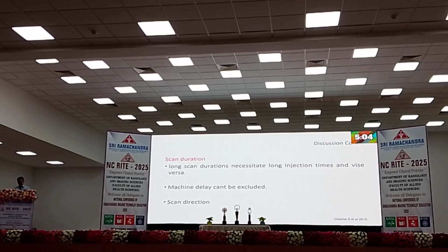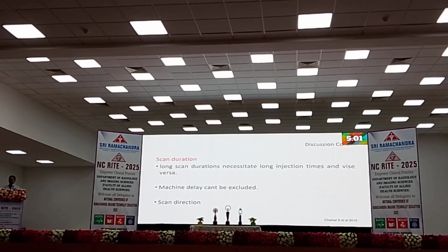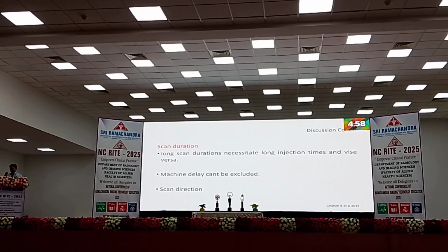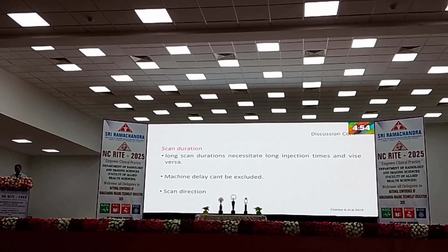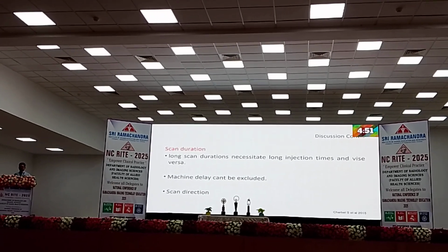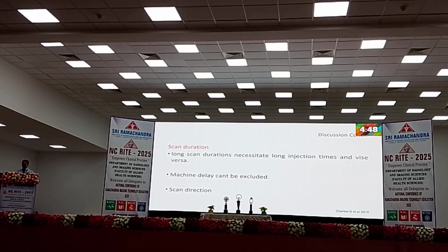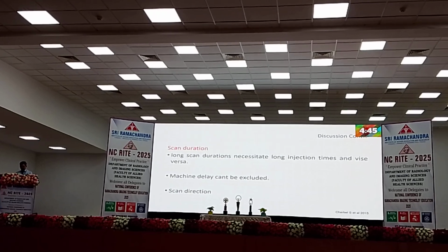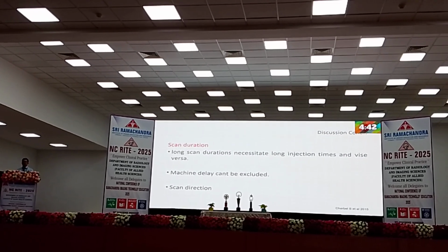And sometimes machine delay, you cannot avoid, because as I have seen, even if the locator and the scan starting area are kept very close or overlapping, you will still find a 1.5 to 2 second delay when taking the arterial phase scan after the peak time. Another one is scan direction. That is also very important whenever you are taking a scan.